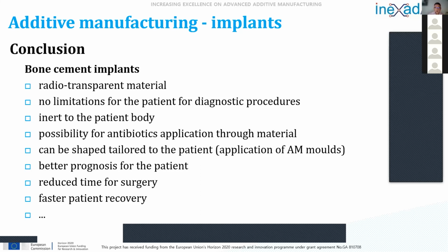I should say that especially in these cases that you have seen in my presentation, especially for this young girl, it's very important that we produce a good implant which fits perfectly on her skull, because she's a young woman, and she pays a lot of attention to her look.